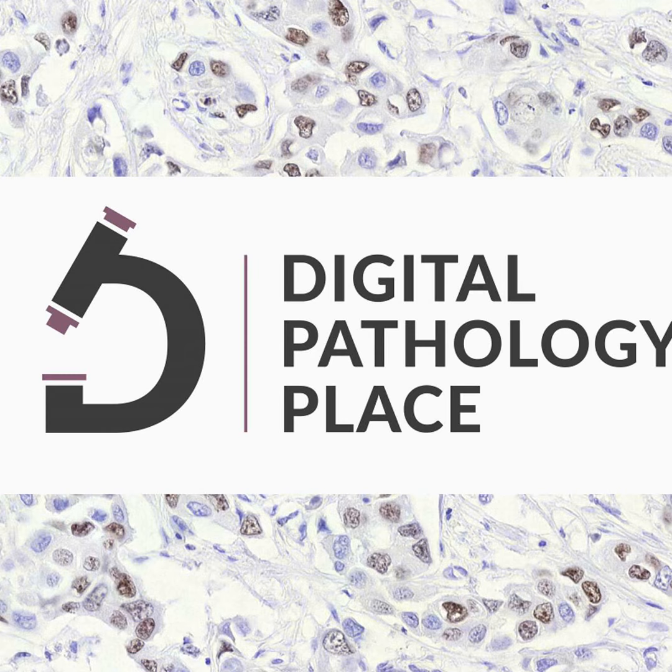So instead of waiting for that tissue block to get put back into the repository, the slide eventually makes it to his desk. He looks at it and says, I can't use this slide because it's of such poor quality. Then you have to retrieve the tissue block from wherever, recut this. I mean, you're talking about days of delay. Now it'll come right out of the scanner.